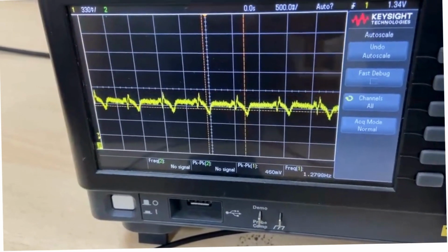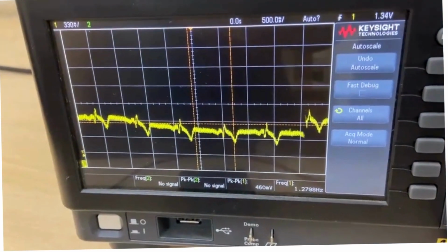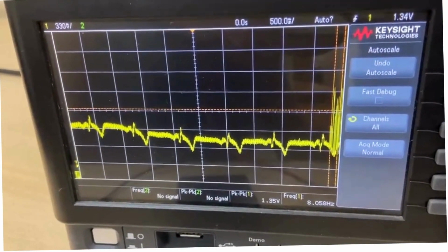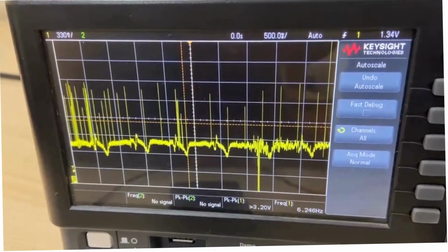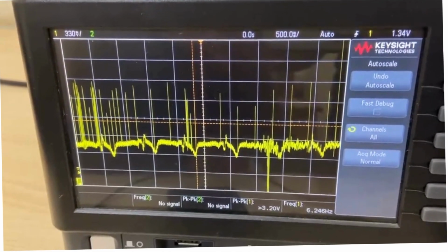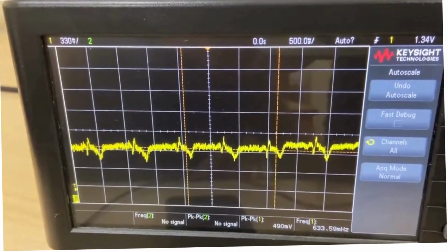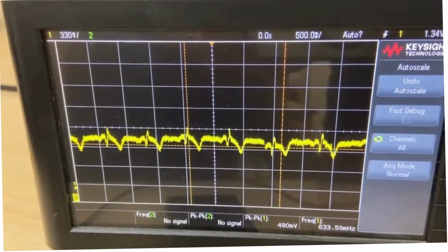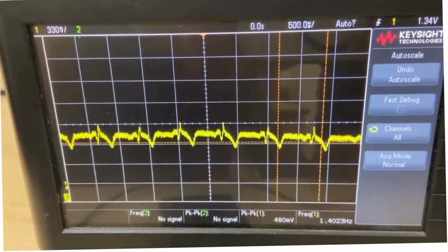And this is our ECG. When our patient tenses his posture or his muscles, there is a change in the ECG. Please tense it. As you can see, there's a change and there's an increment in the amount of noise present. Relax. As we can see, when the patient relaxes his posture, we get a more accurate reading of the ECG. Thank you.